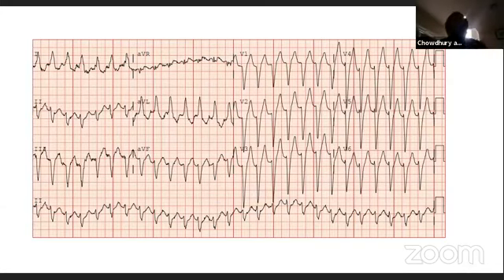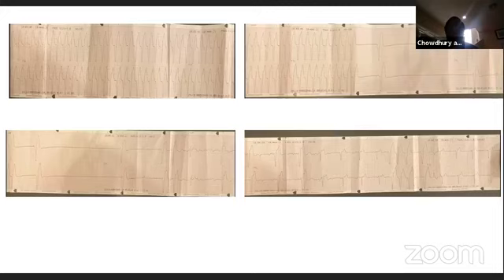Okay, so the fellow did not know any of this. This is our first year fellow. The fellow actually went there. The blood pressure was good. The patient was not tolerating. And the question is, is it tolerated VT versus tolerated SVT? Hemodynamic compromise is never a good way of differentiating. But the adenosine did break the VT.